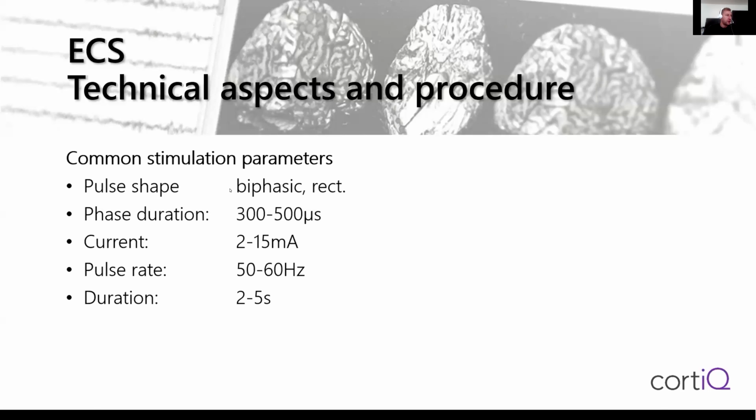So at the end you have a net zero charge after the stimulation, but during the stimulation you're injecting a charge into a volume of tissue and then returning that. Usually a stimulation duration is about 300 to 500 microseconds positive and then negative stimulation. And this stimulation pulse is repeated about every 20 milliseconds. With this, you have a very strong behavioral response or symptom related to the stimulation. There are some language protocols where you even go to 200 to 500 hertz, but the majority of the symptomatic stimulation is done in this region.